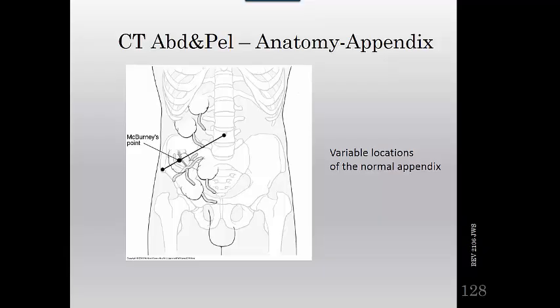Most often, oral and IV contrast are preferred by the radiologists and the ordering physicians. Although non-contrast abdomen pelvis CT scans are less time-consuming for us and the patient, it may not be in the best interest of the patient. It may not be the best exam suited for the patient. So oral and IV contrast provide the radiologist with the best possible view of internal structures of the abdomen. So that's important, even though it takes a little time, that we do it right. And that we let these physicians know when we're on our own and on the weekends or overnight, look, man, you may be putting us both in a bad spot if we don't get contrast.